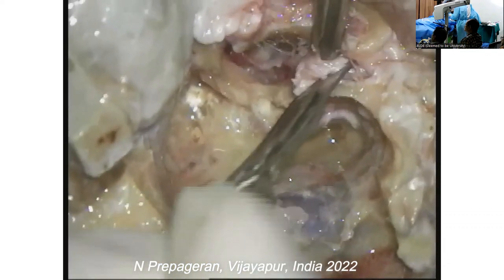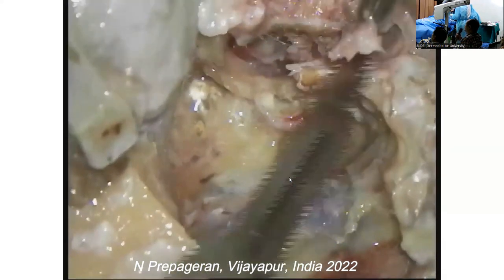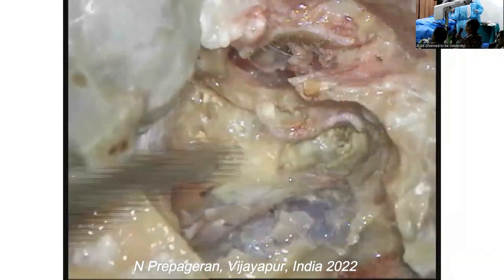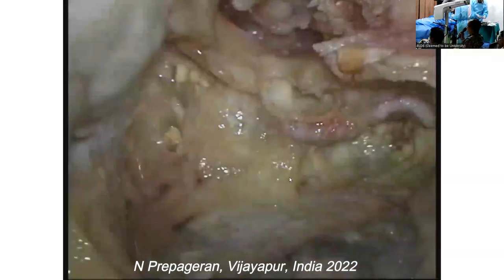Cutting drill. Small cutting drill. Sir, in live surgery, would you like to preserve that skin? No, it depends. If you're doing a blind sac closure, no. It depends on what you're doing. So, blind sac closure. Okay. Yeah, so it all depends on what we're doing.